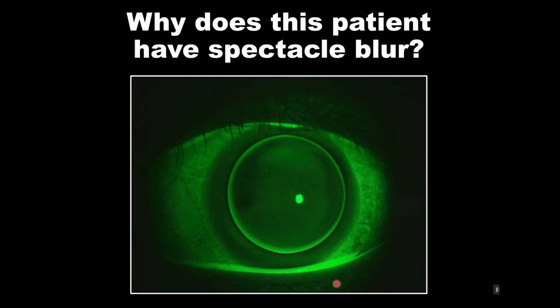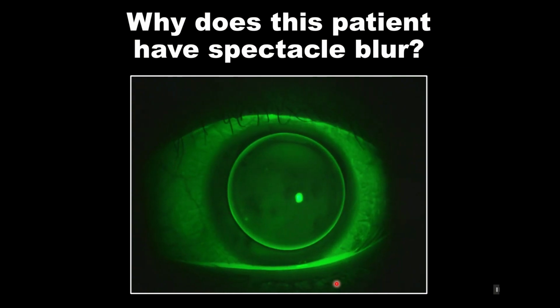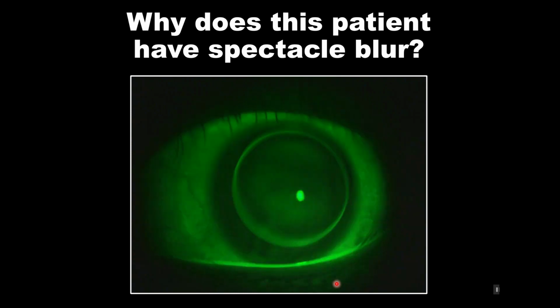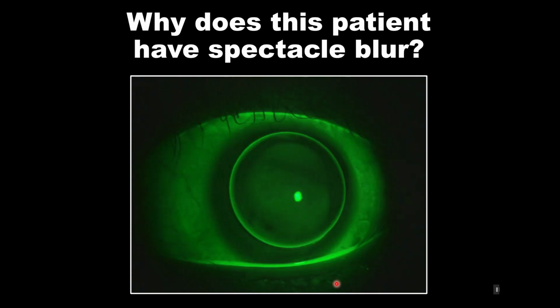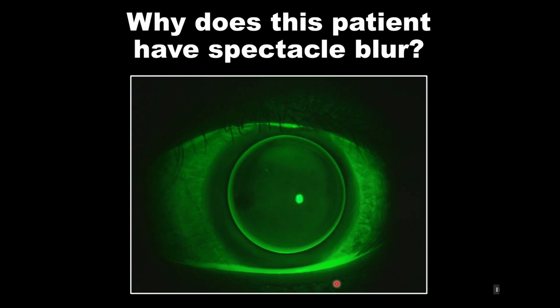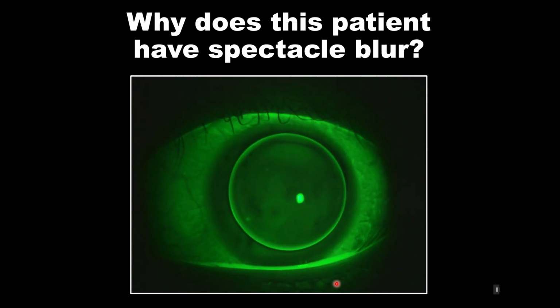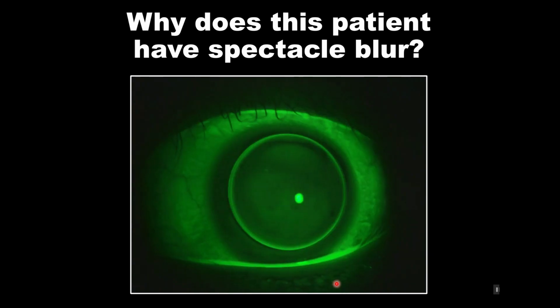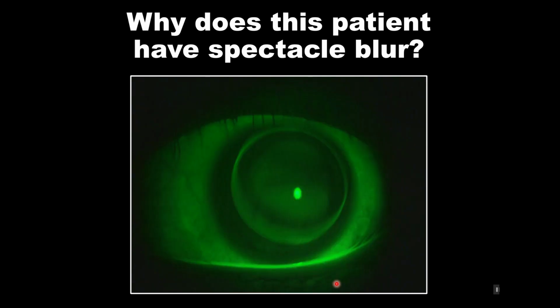Now let's move on a little bit to rigid contact lenses. And here we have a case where the patient has spectacle blur when they remove their rigid contact lenses. And of course, spectacle blur happens when we take off our contact lenses, we put on our glasses, and we just can't see as well with the glasses on for some reason. And it's presumed that the rigid lens may be molding the eye. But here we see a rigid contact lens fit that doesn't look too bad. Is this such a poor fit that it would alter the eye shape?